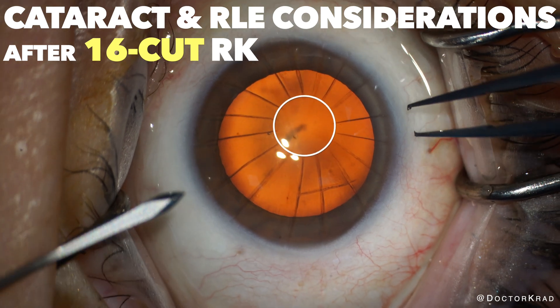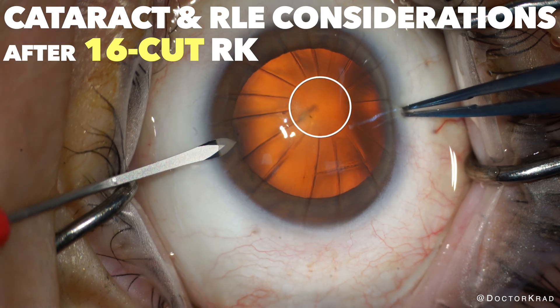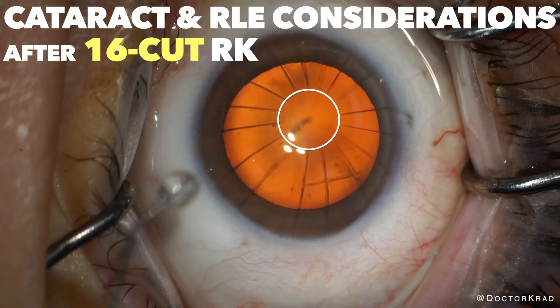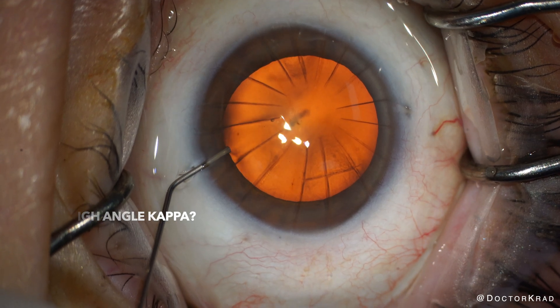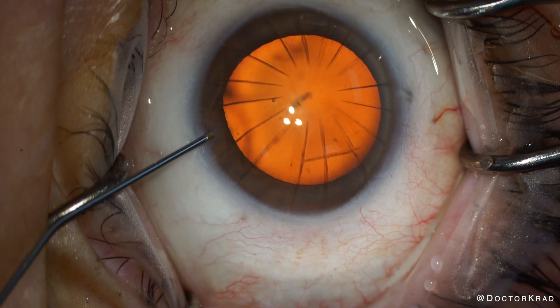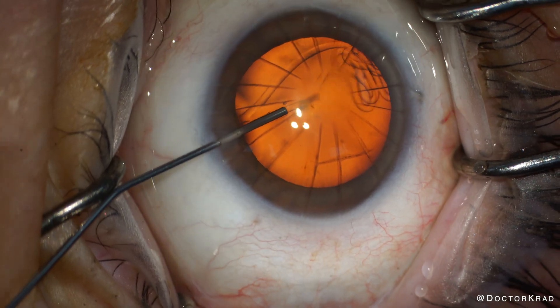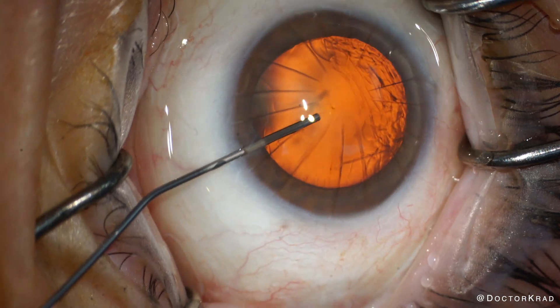Hi everyone, it's Dr. Cradd. Here we have a patient with 16-cut RK with what seems like significant nasal decentration. Cataract surgery after RK can be quite frustrating. Despite doing everything perfectly, you'll sometimes have a significant refractive surprise or poor vision quality despite a good refractive result.